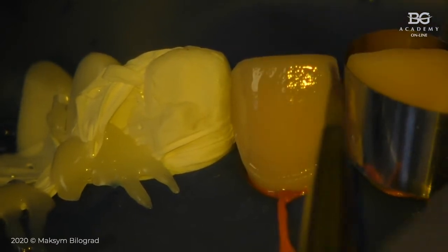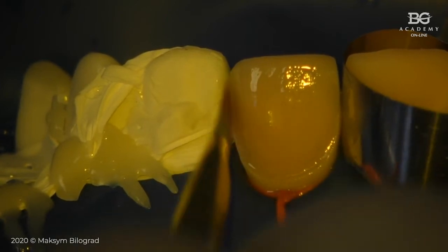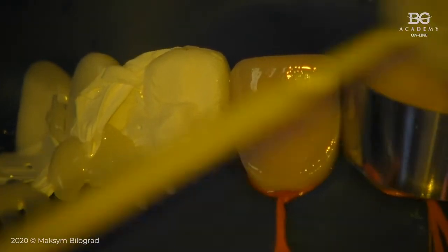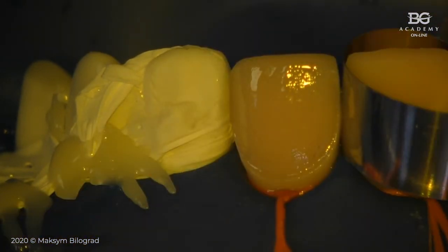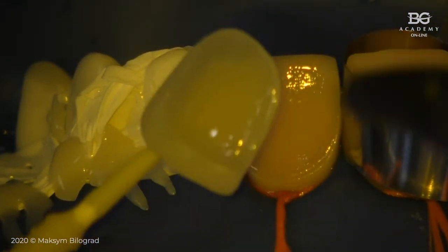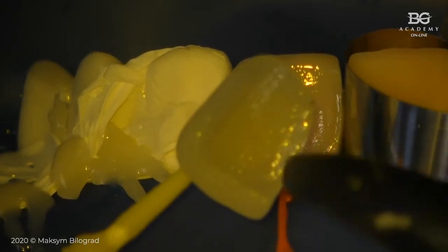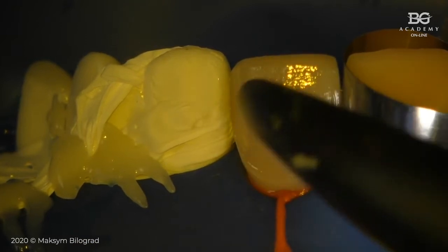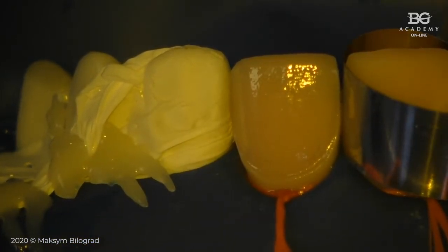And also I'm using a brush, you see, because I can move the brush between teeth to get proper bonding between teeth. So we just put it all over the tooth, all over the dentin. We have to have a really thin layer of bonding agent here, a super thin layer on both, and we are not light curing either on the tooth surface or on the ceramic veneer surface.